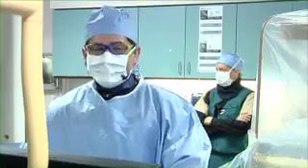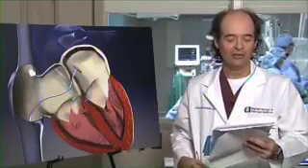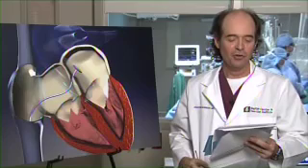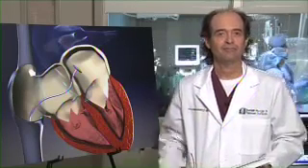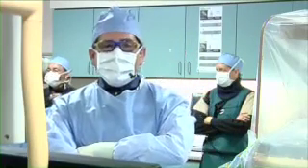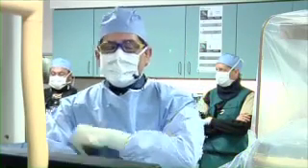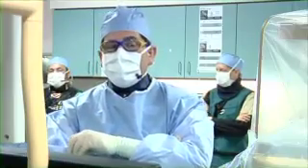Yeah. Another question here, Ramon. What is the expected lifetime of this device? Does this cure the PFO forever? Do you need to replace the device in the future? No. First of all, this device is going to be part of your body indefinitely, for the rest of your life. Now, saying that, there are 2 new devices that are bioabsorbable.